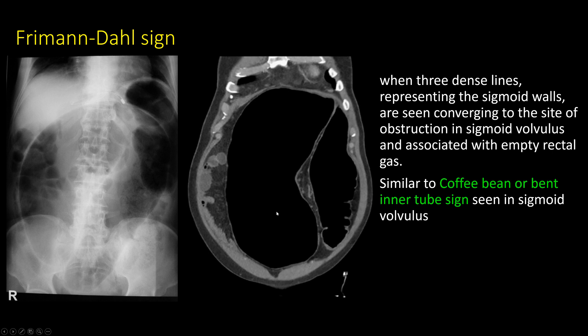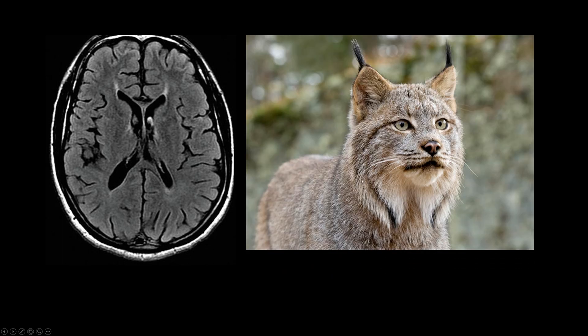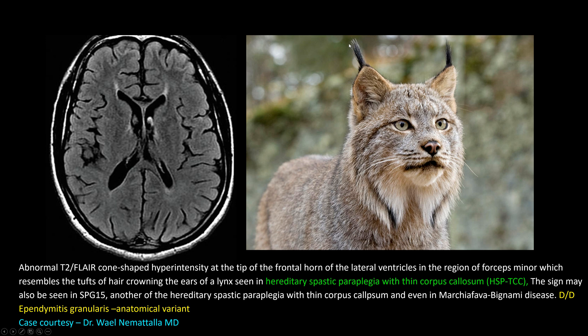Next case: there is thinning of the corpus callosum in the splenium and genu, and cone-shaped hyperintensities adjacent to the frontal horns. This resembles the tuft of hair adjacent to the ears of a Canadian lynx — hence the ear of lynx sign. This is a North American cat with a tuft of hair at the end of its ears, resembling the hyperintense areas adjacent to the frontal horns. This sign is classical for hereditary spastic paraplegia with thin corpus callosum, and can also be seen in SPG15. It is rarely seen in Marchiafava-Bignami disease. A close differential is ependymitis granularis, which is an anatomical variant.